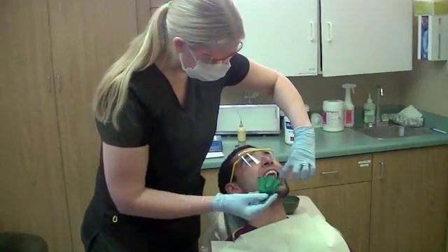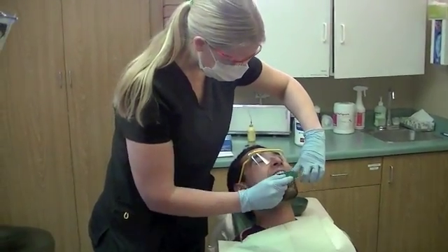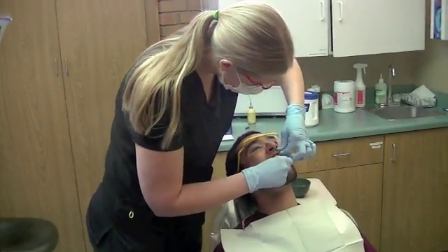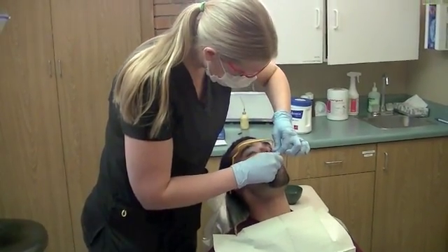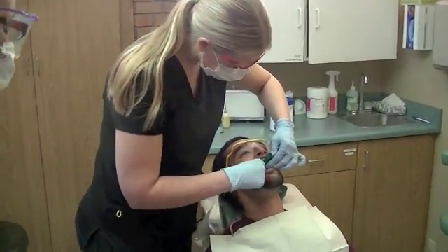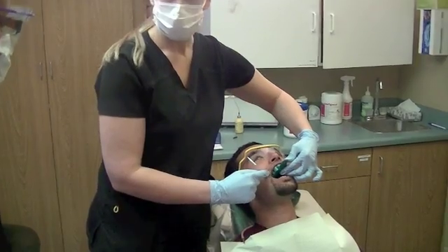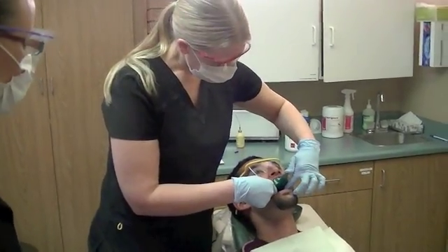I'm retracting his cheek away with this finger and with this hand I'm retracting away the cheek right there. And then I'm going to pull his lip out and push it up, so that way his lip is over the tray. How much do you want to push it? You just want enough just to get it seated.